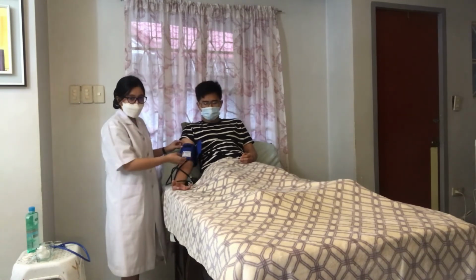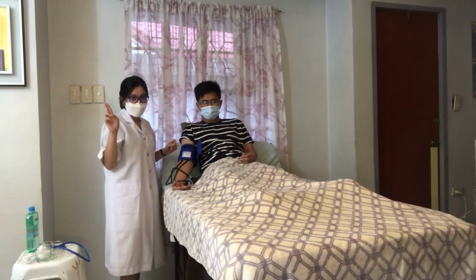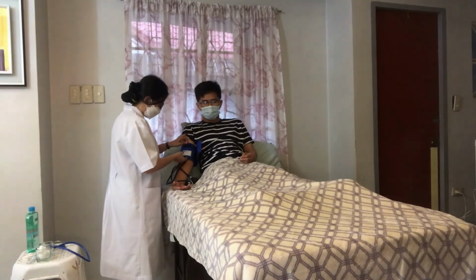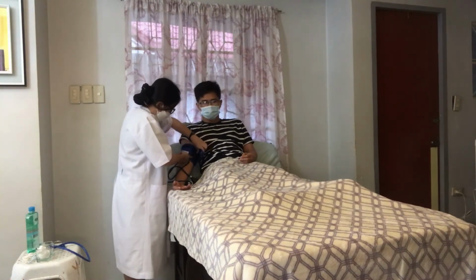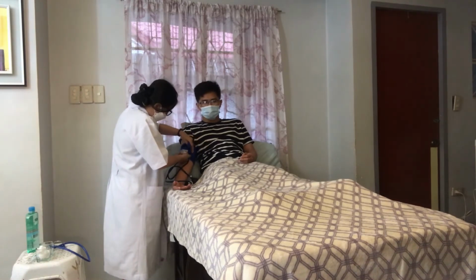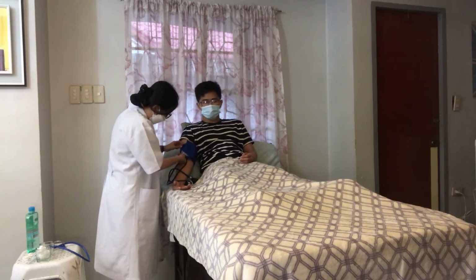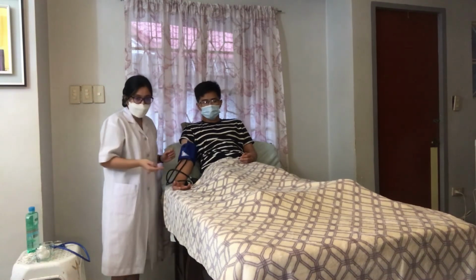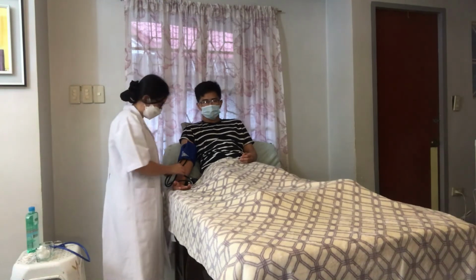So now we are going to check if the cuff is snugly fitted by inserting 2 fingers into the BP cuff. Now after that, we have to make sure that the tube is placed in line with the brachial artery.